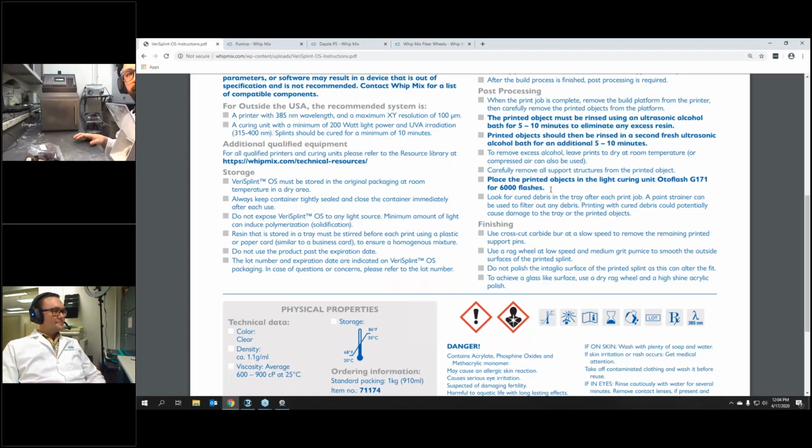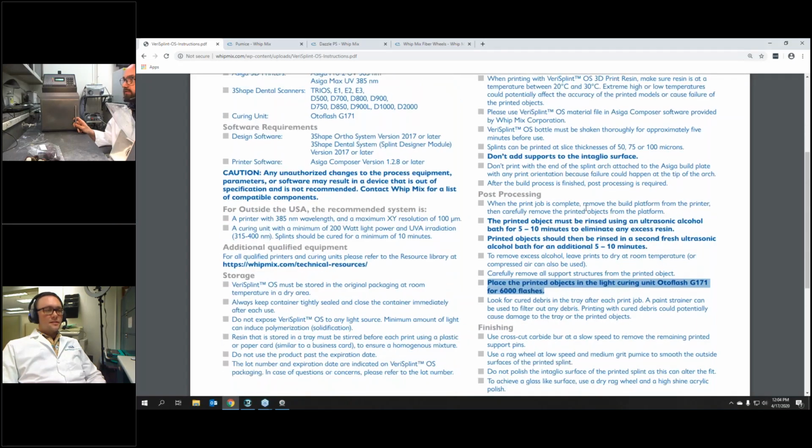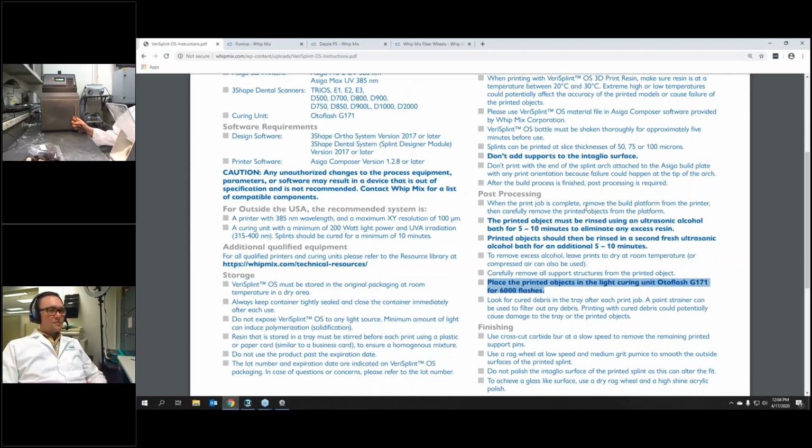All right, so from here, the next step after we do the alcohol bath is we're going to go ahead and cure it in a curing unit. So from here, if you were to scroll up, Evan, I think this also shows, this is the older IFU. Yes, there is an updated IFU coming out. This is just the one that you would get off our site, but we have made some changes, which will also include having the IntelliRay and the Sunray in the instructions for acceptable curing units. And the one that you see over there with Cory is the IntelliRay.